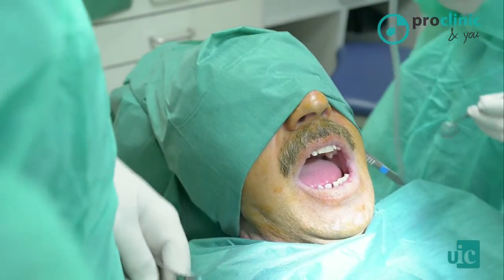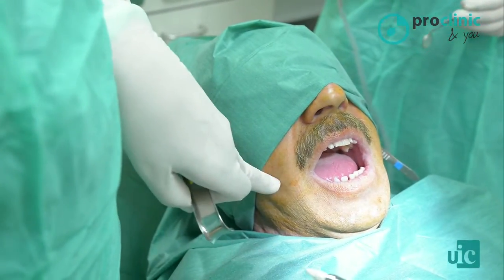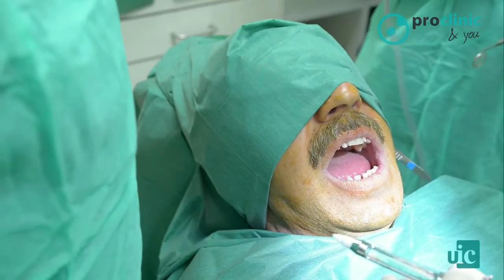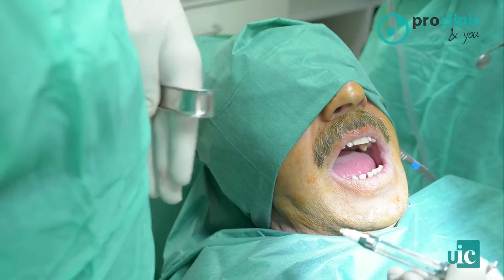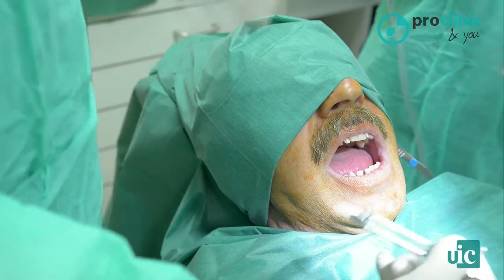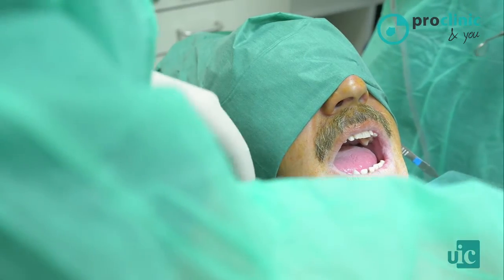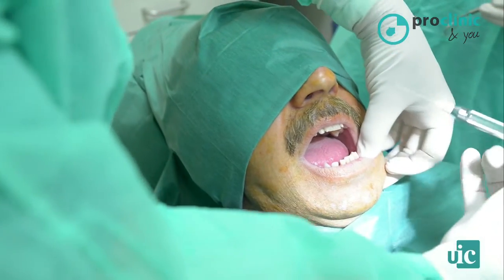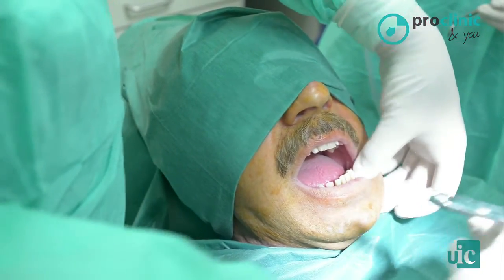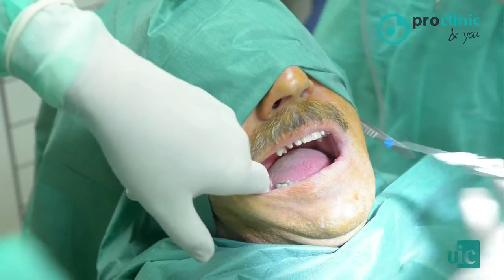We try to infiltrate the anesthetic into the Spix's spine, which is located on the inner or medial surface of the ascending ramus, where the inferior alveolar nerve penetrates into the mandible. To do so, we have to place the syringe at the contralateral side, generally located between the premolars, and then to direct the needle towards the inner surface of the opposite side.